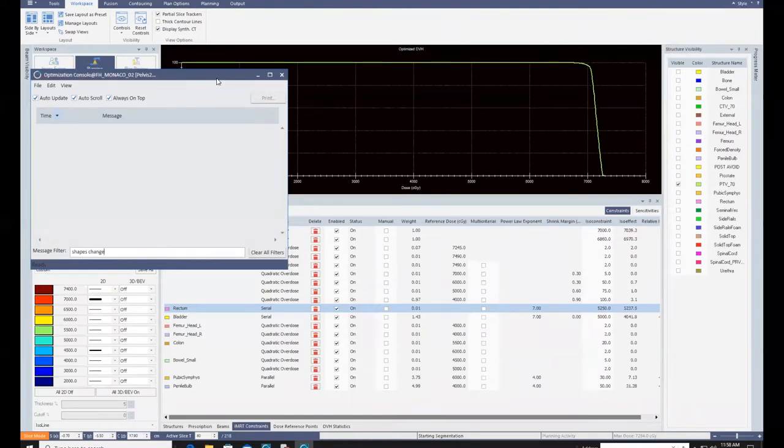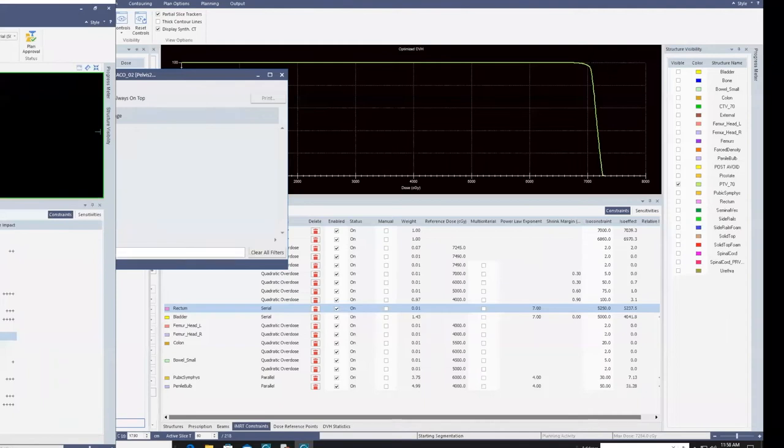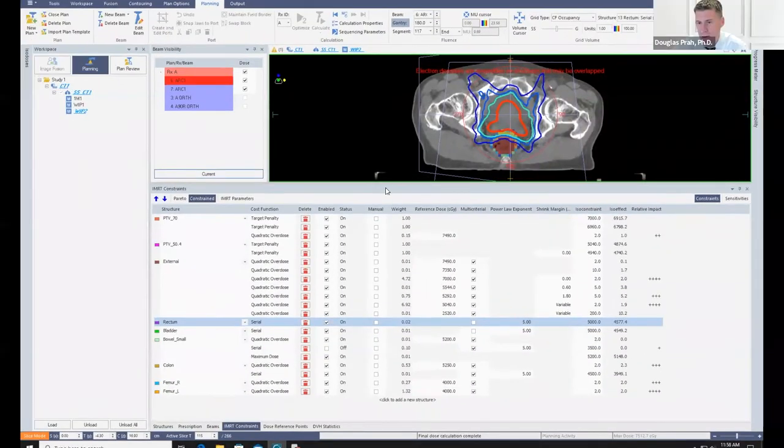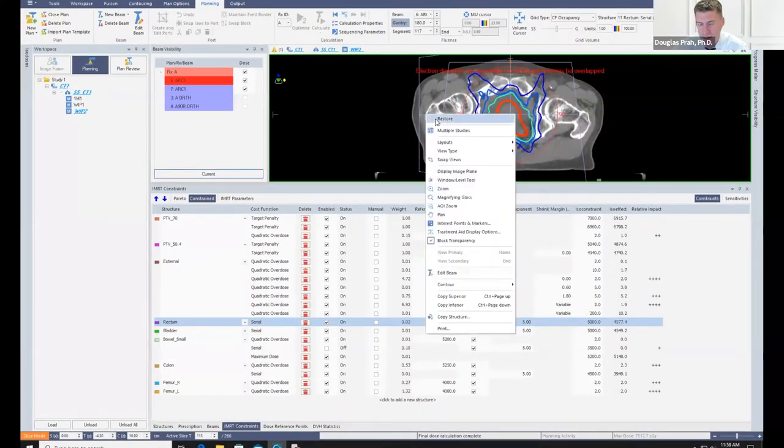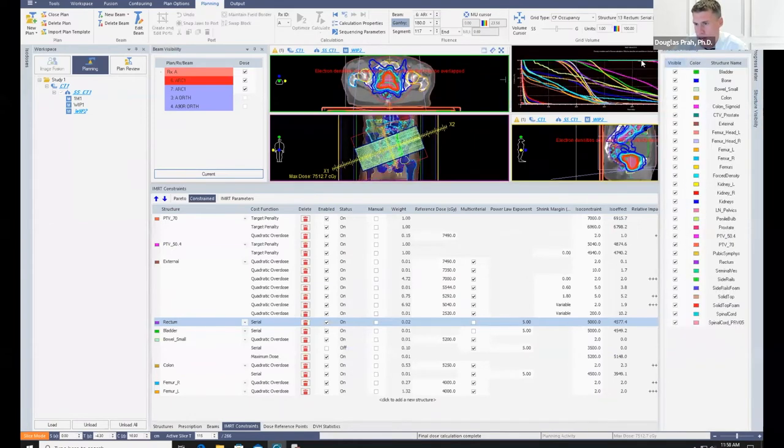Yeah, thanks. So for the previous cases regarding the MCO, did you check the MCO for stage two? Because I saw that it's checked and then you already got the final just completed. On the other plan? Yes, the other plan. Yeah, so this plan I ran previously, I don't know that it's completely done, but I can pull it up while this other one's running. We have to be patient. It's Monte Carlo. It can take some time.